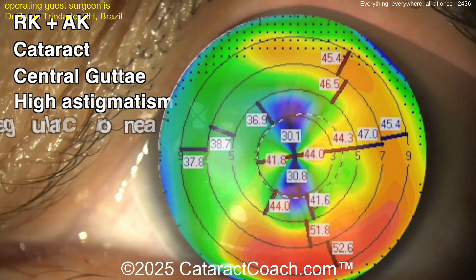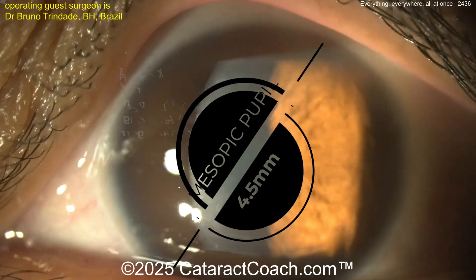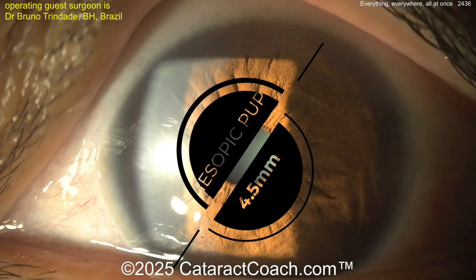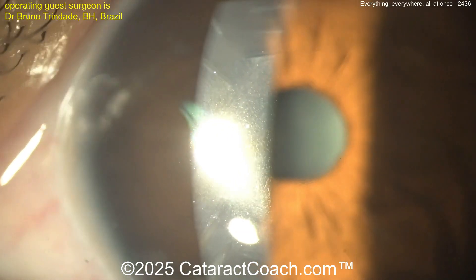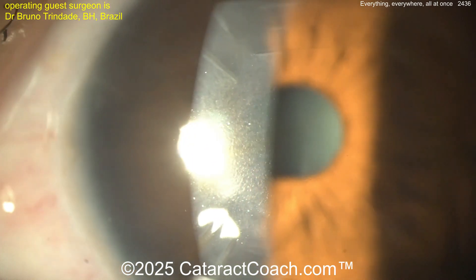Here's the topography — a large degree of regular astigmatism, but still looks like a lot of astigmatism and there is some irregularity in the cornea because of those cuts. The patient unfortunately has a large mesopic pupil which lets in so much of that aberrated light. You can see the central gutae there; the peripheral cornea looks a lot better, so maybe some early Fuchs dystrophy.